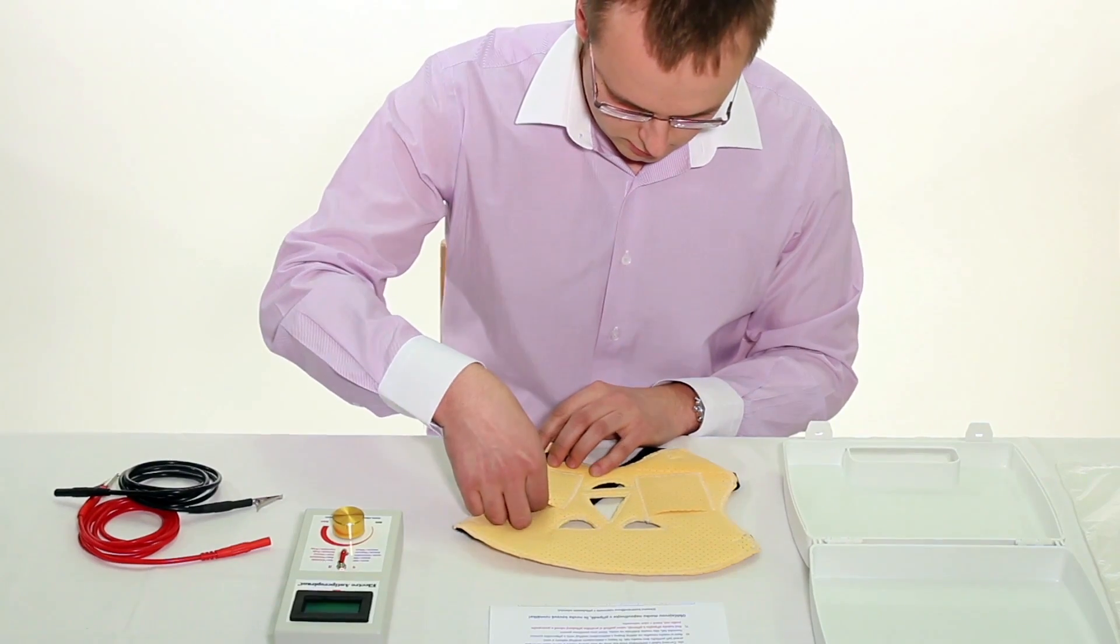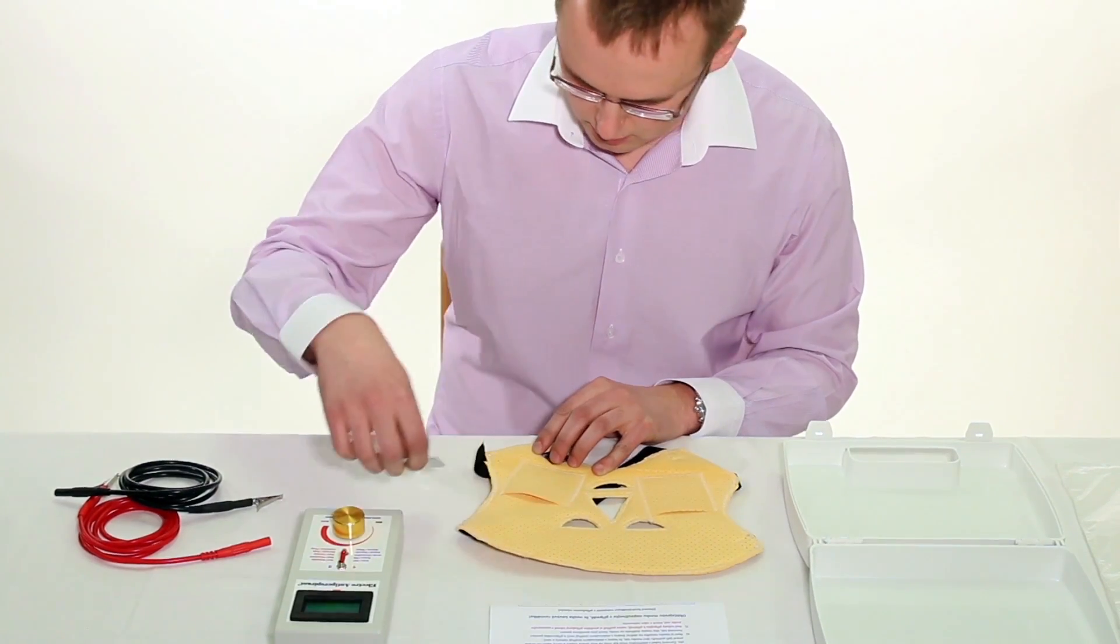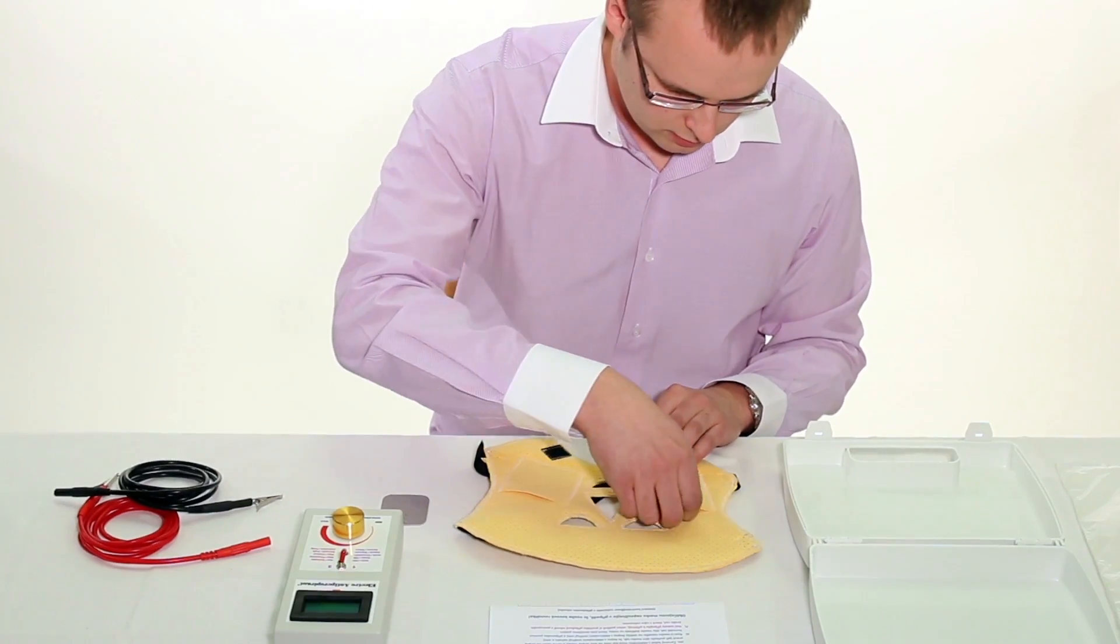In the pockets of electro antiperspirant face mask you will find special small electrodes. Take them out.